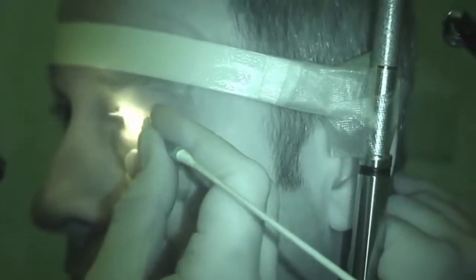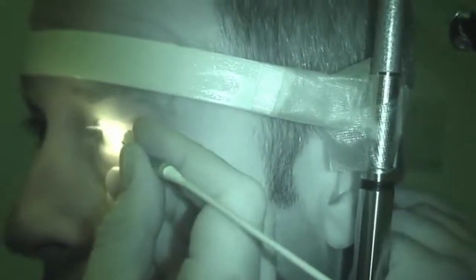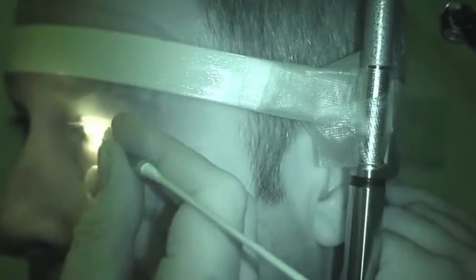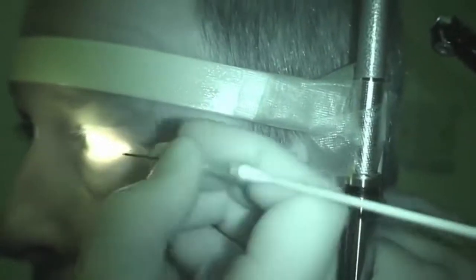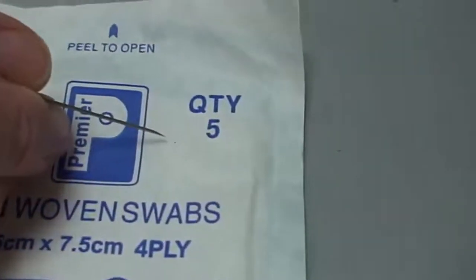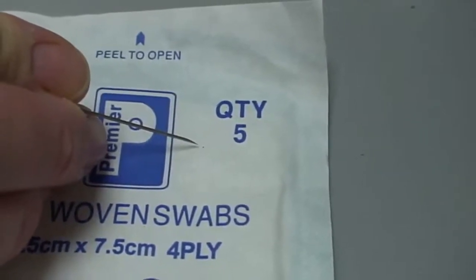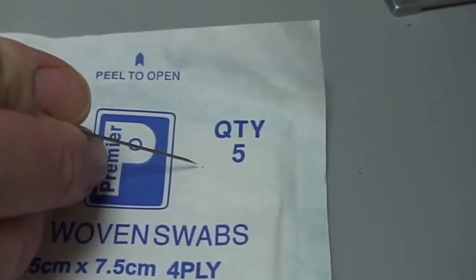I touched your eye there — we're done. We're going to put the lights back up. This is the foreign body that we've just removed from the cornea, just adjacent to the point of the needle. It's probably no more than about a millimetre across.